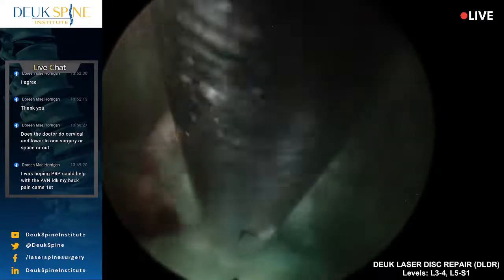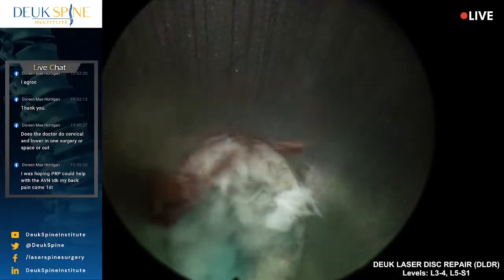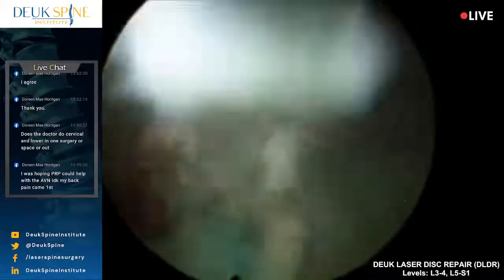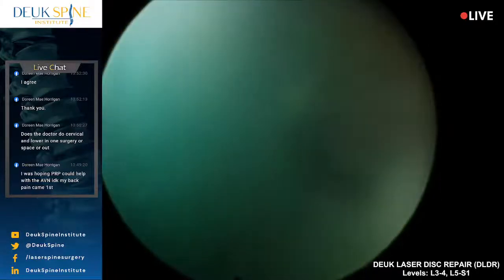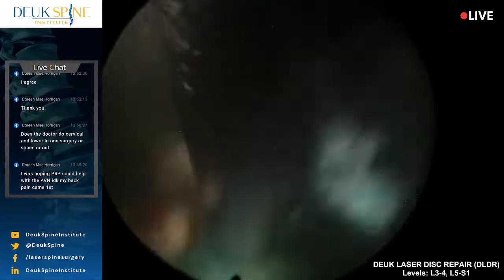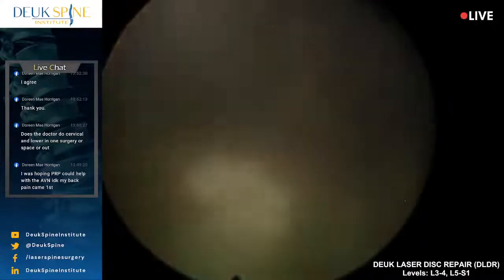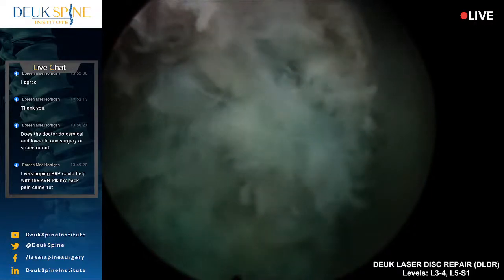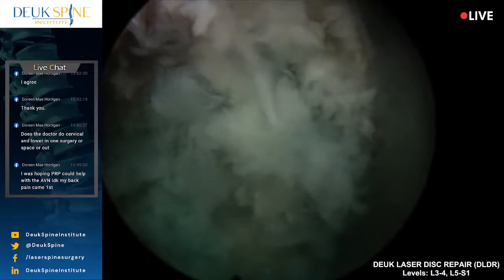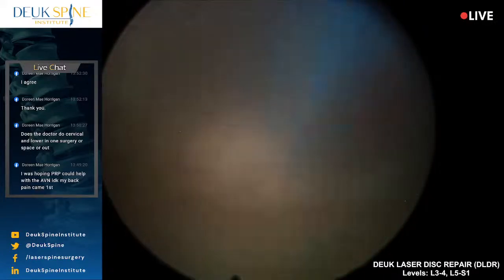Basically, it's a pretty good size herniation on this side. I've shoved the herniation from the foramen, I pushed it in with the dilator. This was developed by Dr. Anthony Young, Dr. Tony Young, one of my mentors in endoscopic spine surgery out of Phoenix. He taught me what's called the inside out technique, where you start inside the disc and you work your way out. The reason that's important is there are people who go outside in, and those people have a completely different philosophy about the treatment. I don't think the outside in is safe. I think the inside out is much safer.